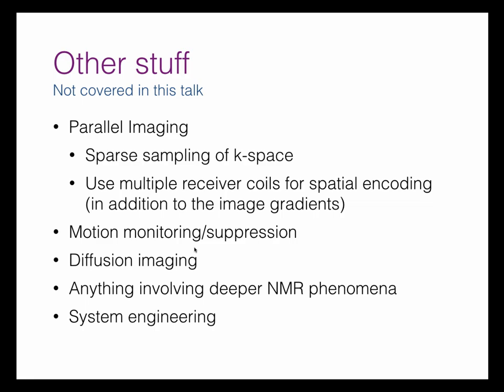There's usually a little bit of latency involved. The concern is that if you have too much latency, with pulsatile motion you might end up applying the correction at exactly the wrong time. These things tend to be very sequence specific. On some of the GE scanners here, we have a system called PROMO, which helps with the MP-RAGE scans.